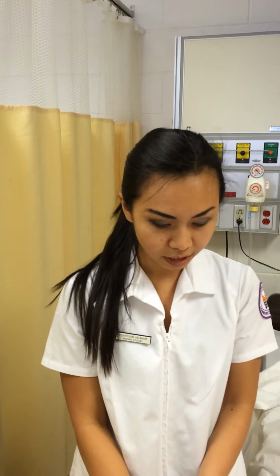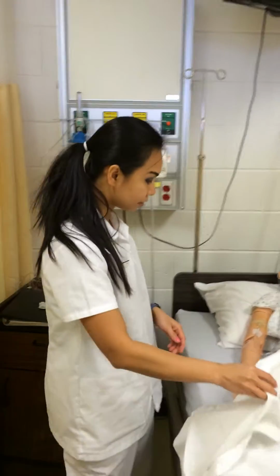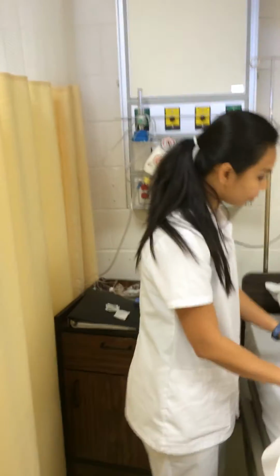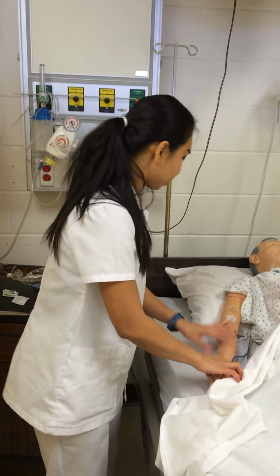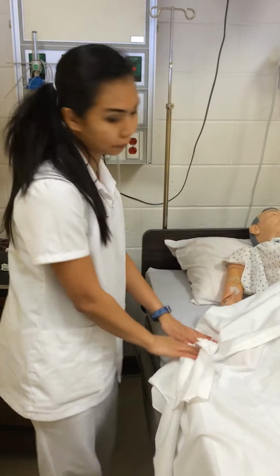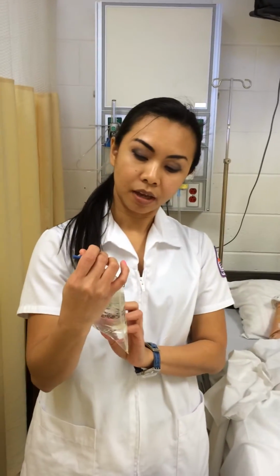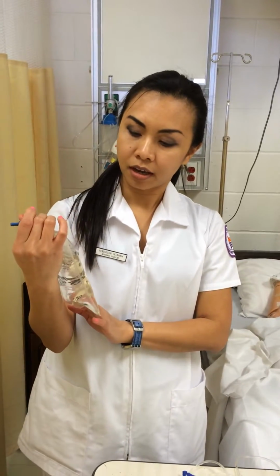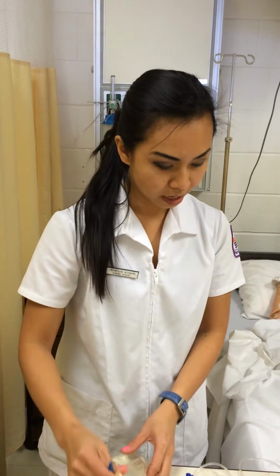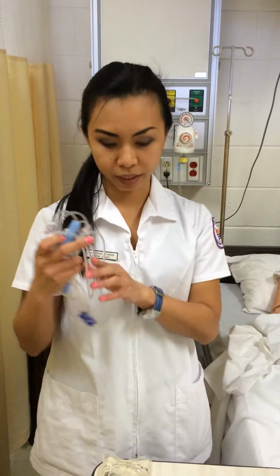After I wash my hands, I'm going to check the patient. I check the IV site, making sure there's no redness or swelling. Everything looks okay. Now my equipment: I have IV solution and tubing. For the IV solution, I make sure it's not expired and it's the right solution, and the tubing. So I label the tubing and I label the solution.